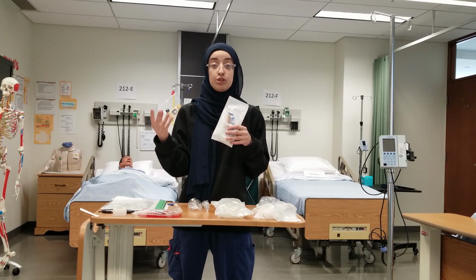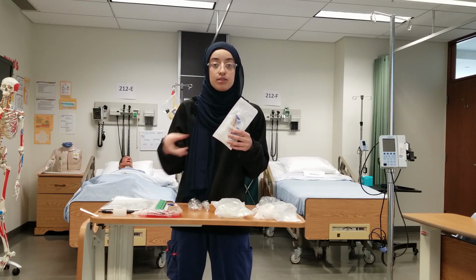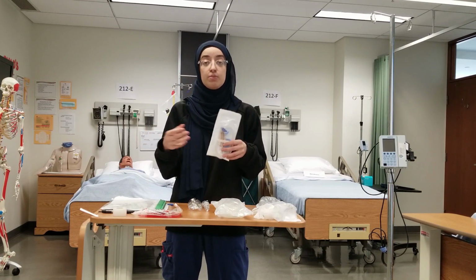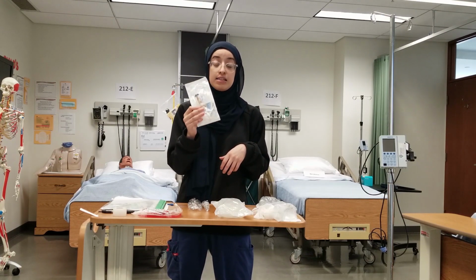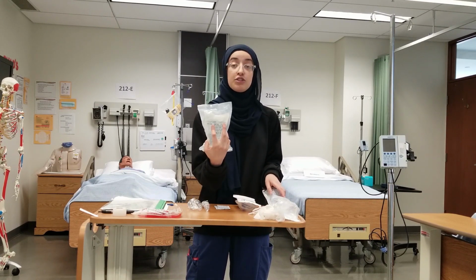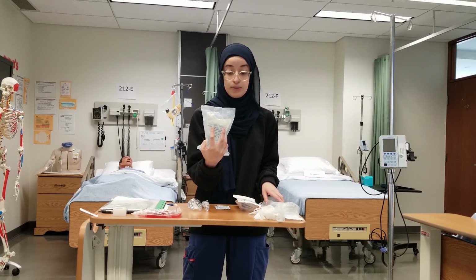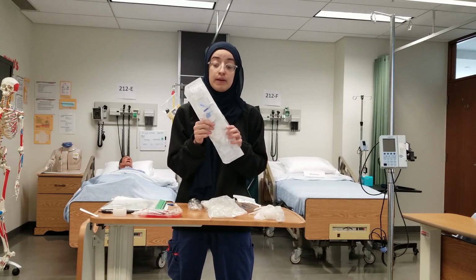If I use that same tubing and that patient had a reaction to the blood, I'm just not fixing the problem, and I'm just pushing more of that blood into the patient's body. So we want to make sure that we have a set of fresh, clean tubing aside in case there's an emergency situation. I have gloves and I have a 500 bag of normal saline that I'm going to use to prime. And then I have filter tubing or Y tubing.